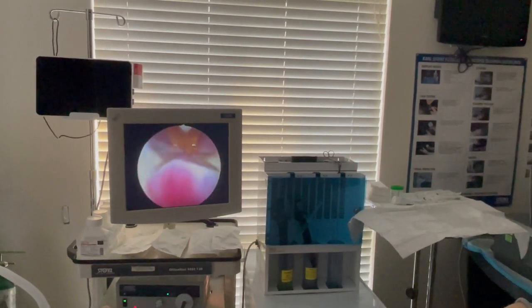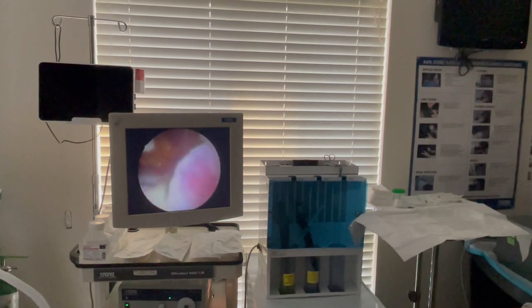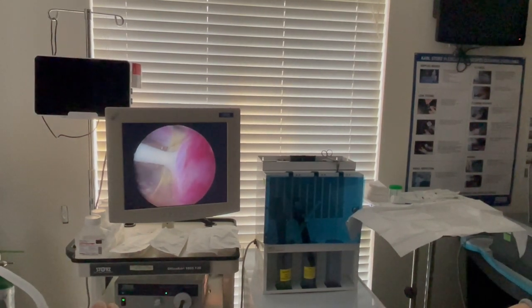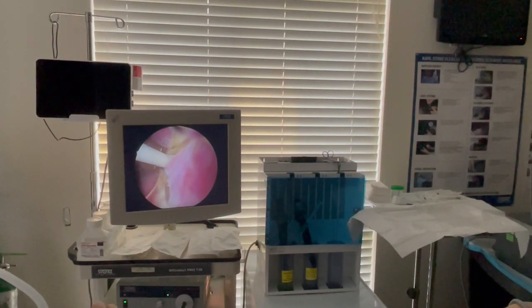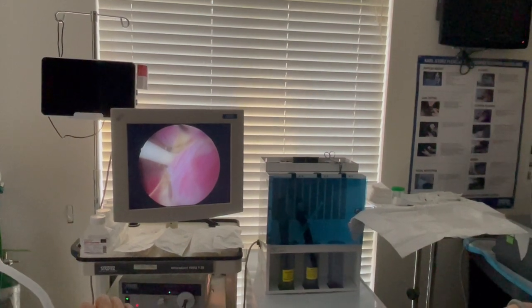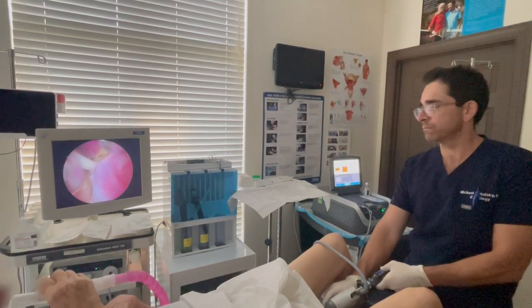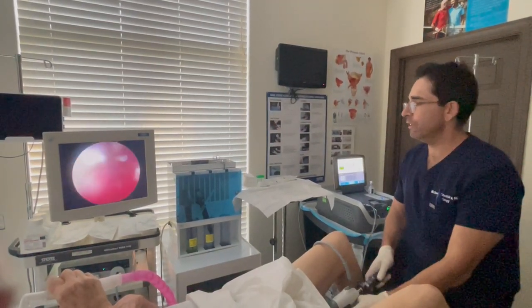Here's the verumontanum. He's had a catheter because he was in retention. We see he has a short, small urethra — about one centimeter. We're able to treat him really nicely because he's on nitrous. But we're also going to make sure to really treat him well because he's in retention and he's a little older. Our margins are one centimeter past the verumontanum and one centimeter distal to the bladder neck.